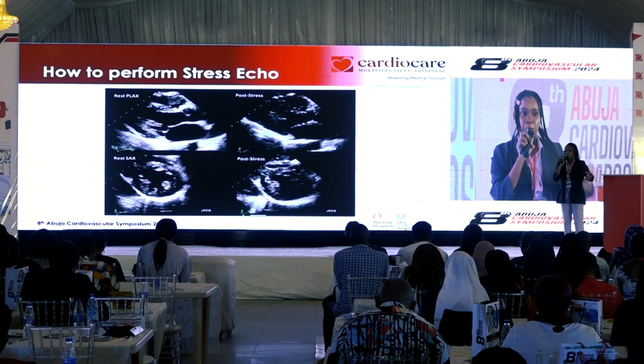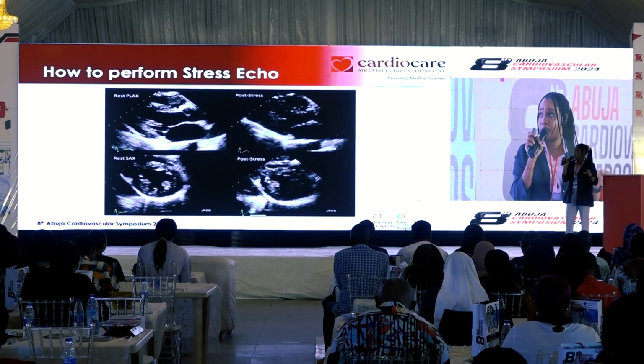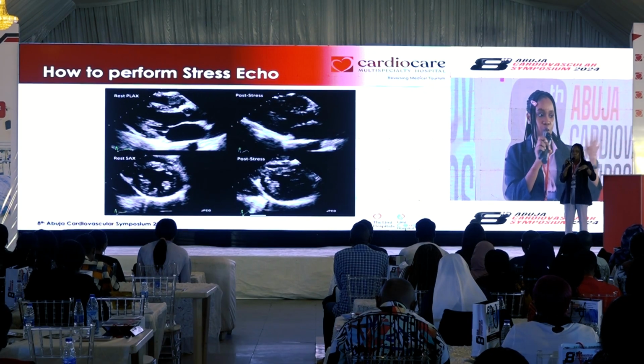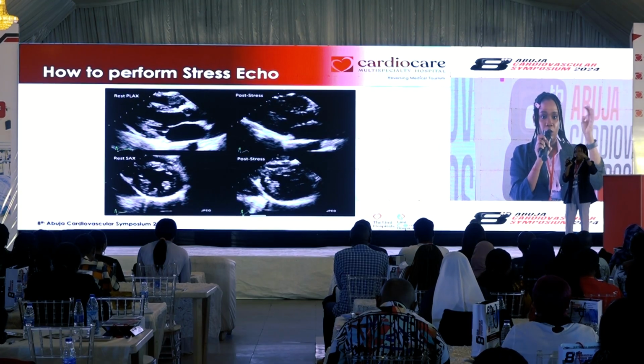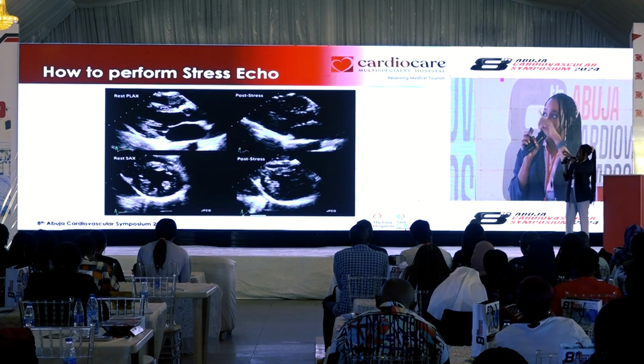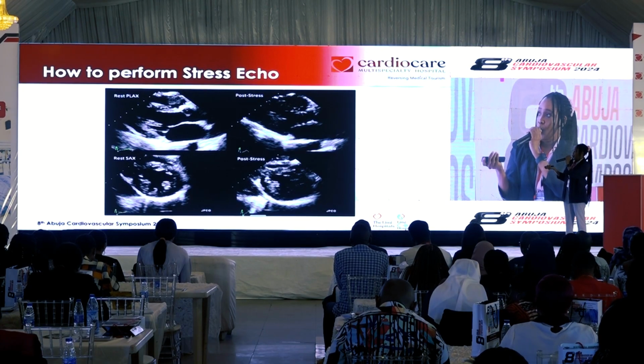Okay, so what we look out for in stress echo most of the time is if there are wall motion abnormalities. When some people are at rest, you won't be able to appreciate all those wall motion abnormalities, but once their hearts are stressed, we will be able to visualize this properly.